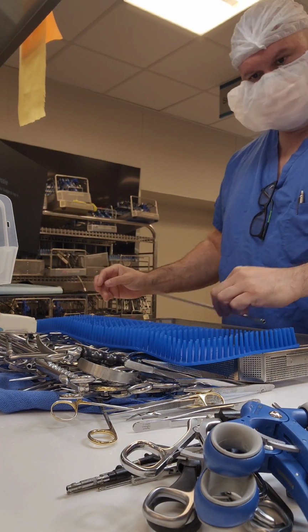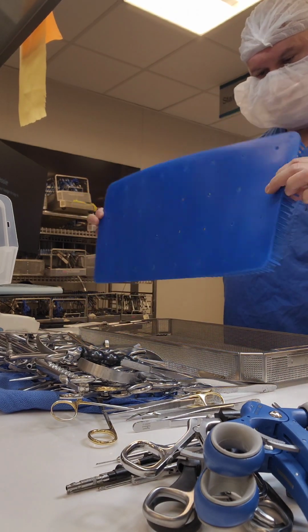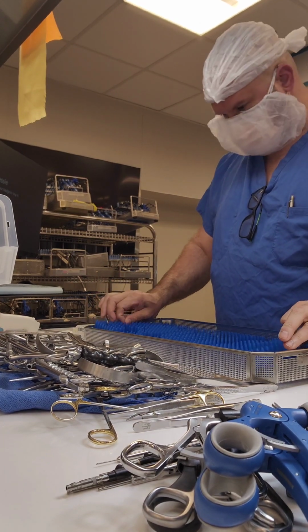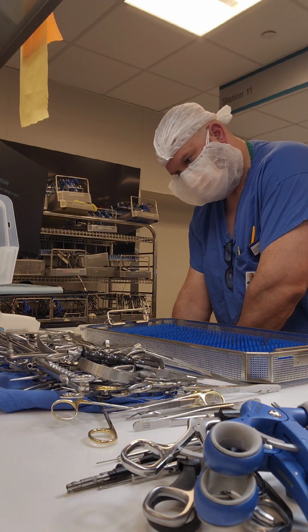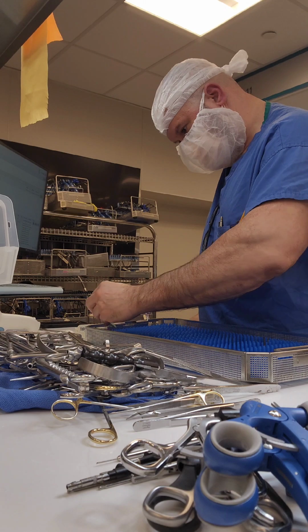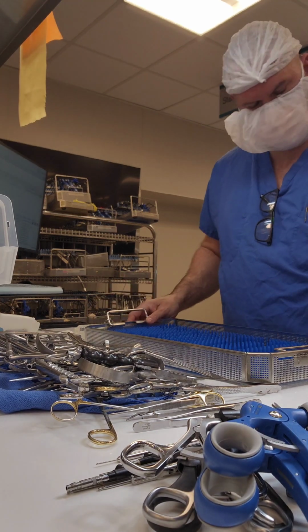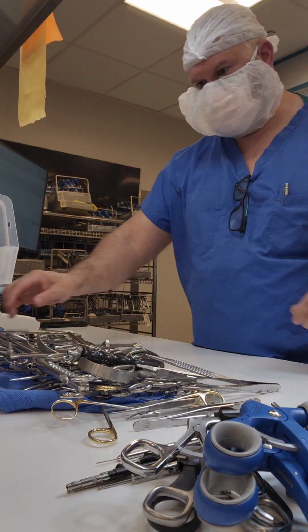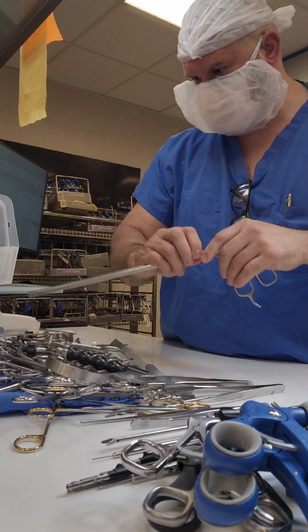And next is checking this silicone mat here that actually should have been removed out of the tray when cleaning, but that's a subject for another video. So here I am placing the mat back and putting some indicators in there, right? Following the IFUs for rigid containers and putting type 5 indicators in there, one on the opposite side of each corner.